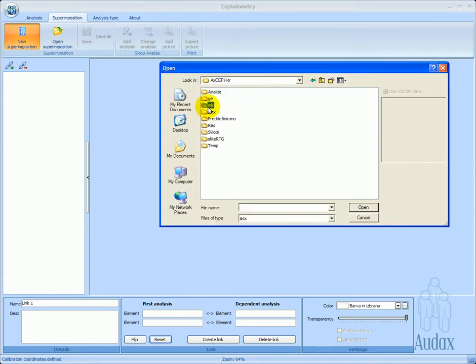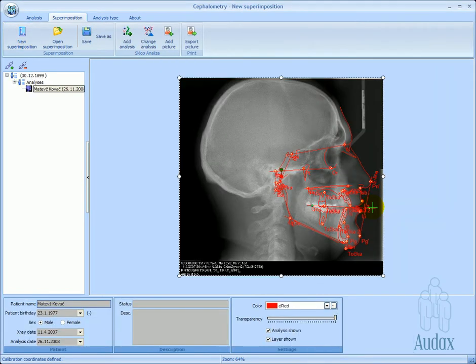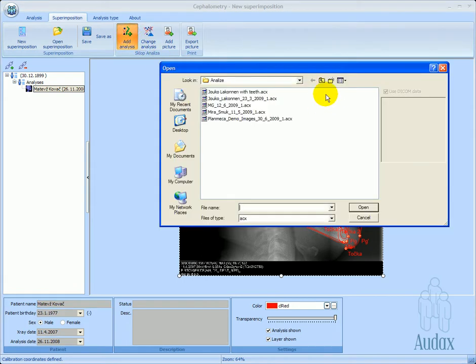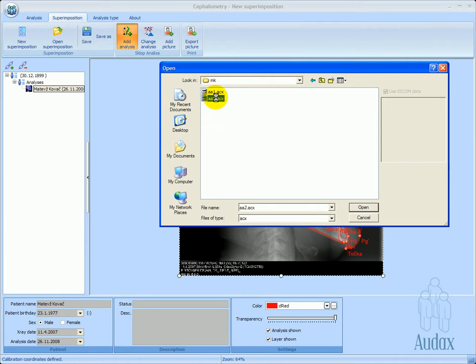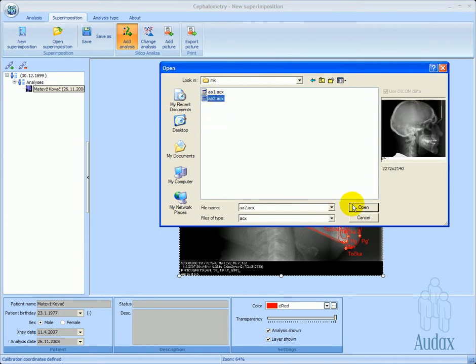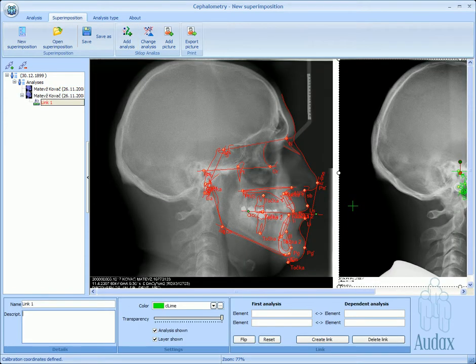To create a superimposition, a minimum of two analyses are required. Let's first choose the older analysis and place it into the assembly. The second analysis is newer, and possibly from a different x-ray apparatus.